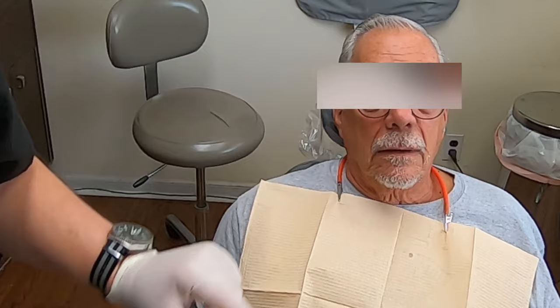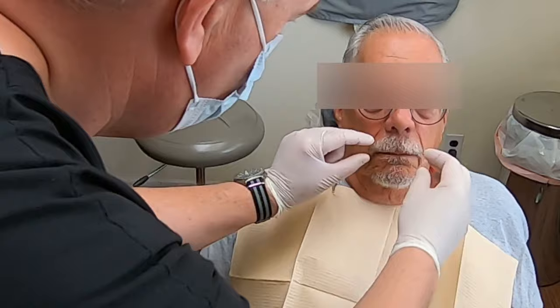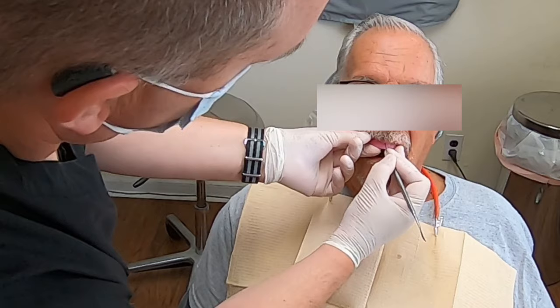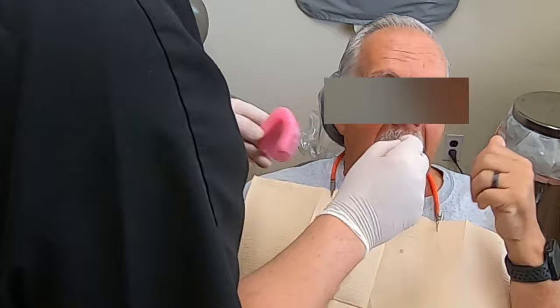Now I'm making sure there's enough support for the lip. You don't want patients to have a sunken-in look for their upper lip, so you have to make sure the wax is far enough out toward the lip to give enough support — it helps minimize wrinkles and gives them a much better appearance. Now that we've confirmed that, I'm marking the midline on the wax rim and also marking the width of the nose. The width of the nose is a guideline for the lab — that's how wide the six front teeth should be. The midline is where the two front teeth touch, and canine to canine should match the width of the nose.